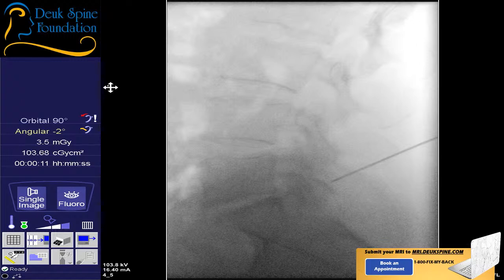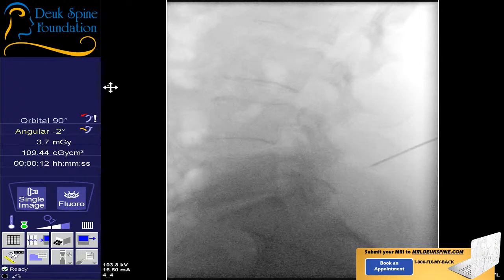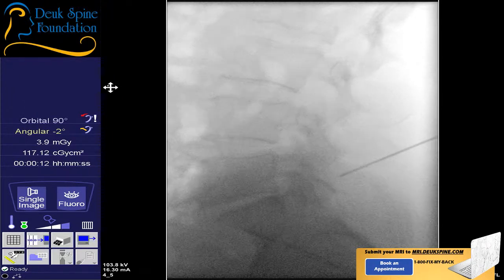Now when I say shot, folks, I'm saying shot as in take a picture. That's just the way I was brought up. Shot. And every doctor says different things, but shot. It's basically take a picture with an x-ray.